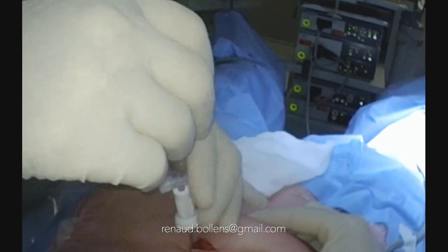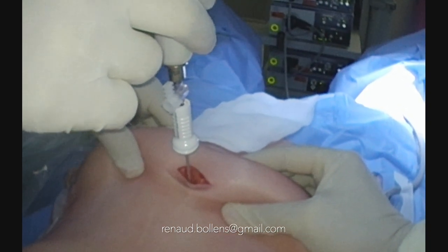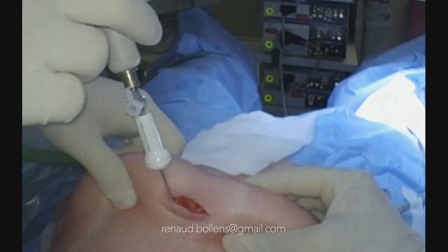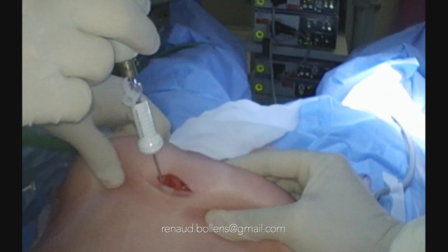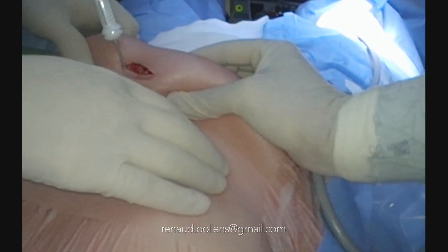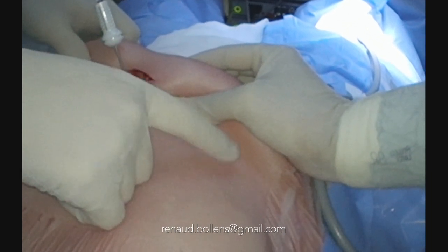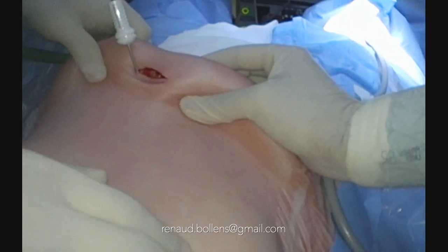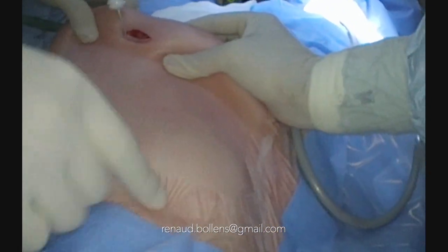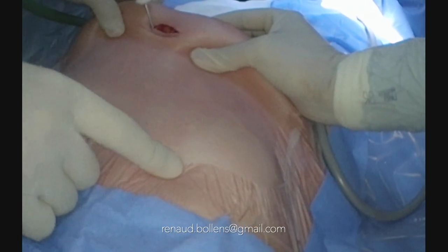Now we can connect the gas and we start with low flow. I lift up the wall. Okay, we start in low flow and we wait to have 200 or 300 milliliters of CO2 inside. And now I check if I have started to inflate inside the abdominal cavity. If you check at this level, it doesn't make sense because at this level you also have the colon. If I inflate inside the colon, it will sound tympanic, but it's not correct. You must check at the level of the liver because at this level I know that I have no colon. Then I should have, like here, the tympanism is evident. Then I'm sure that I've inflated inside the peritoneal cavity and not inside the bowel.